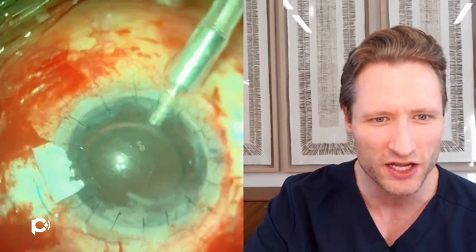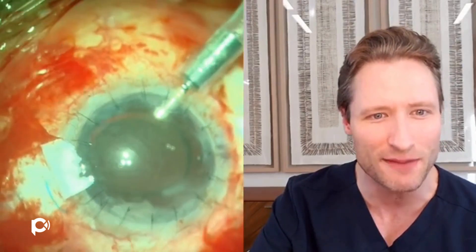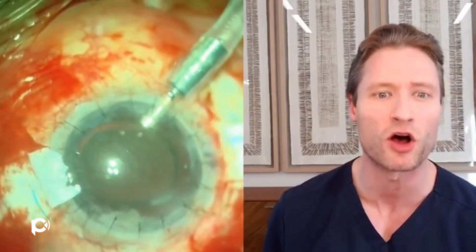Here I'm cleaning up some of this iris tissue — cutting and removing it. There's the IOL sitting stably in the center of the eye. It's tempting just to leave it, but it's 10 or 15 diopters the wrong power, so we can't. What I'm going to do is grab it, cut it with coaxial scissors, and remove each half from the eye. This is done very safely and predictably because the haptics in the sclera hold the lens and prevent it from dropping.